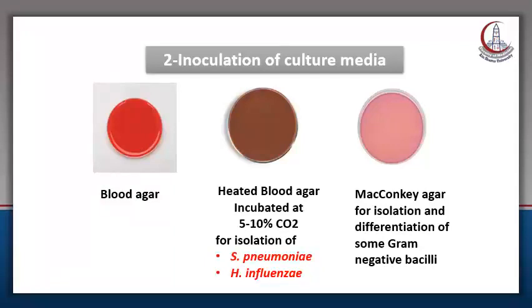Don't forget, as we are talking about the steps of processing the sample, first of all was the direct gram smear. So the second step is inoculation on suitable culture media. How we choose from the different culture media, as we are suspecting typical pneumonia, most common causative organisms.